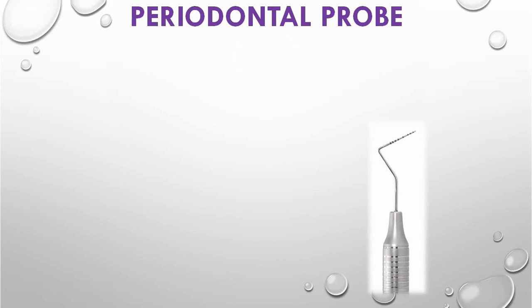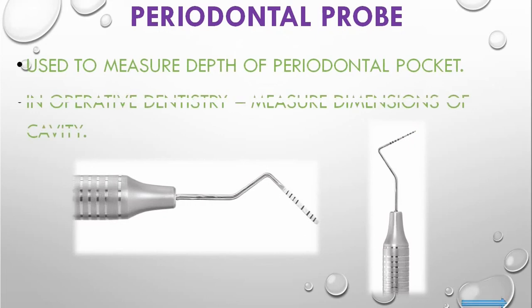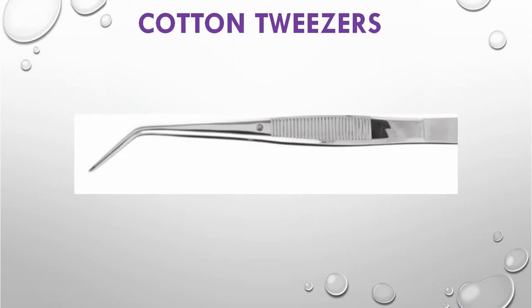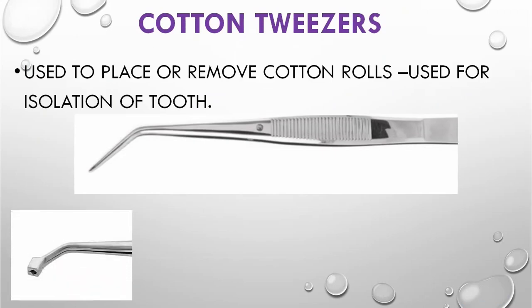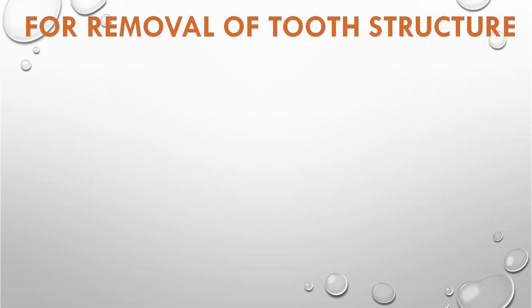The periodontal probe is similar to the explorer, but its tip is not sharp and it has markings on it. It is used to measure the depth of periodontal pockets and, in operative dentistry, to measure cavity dimensions. Cotton tweezers are basically a plier with angled tips, used to place or remove cotton rolls for isolation of teeth and to carry small items like cotton pellets to dry the teeth.